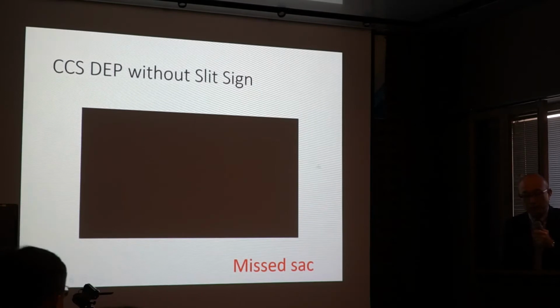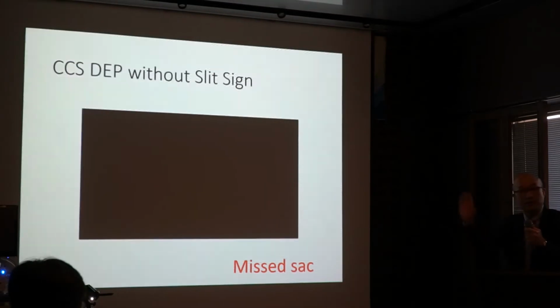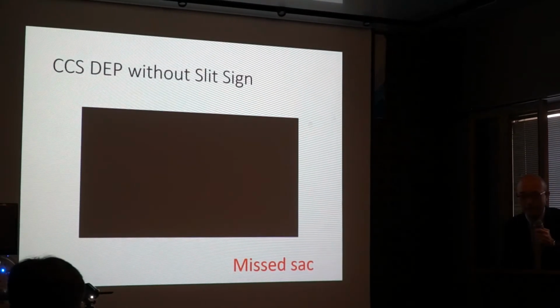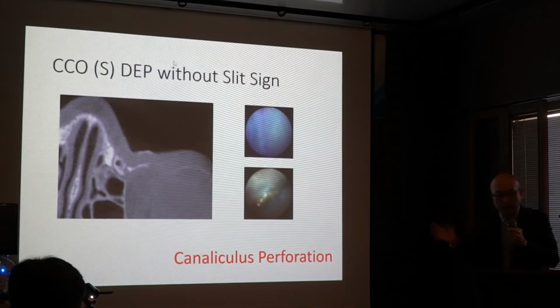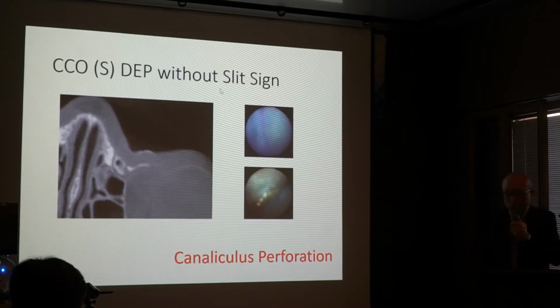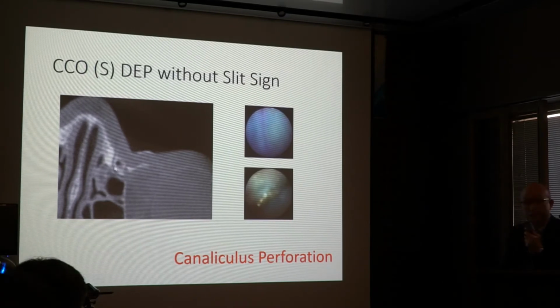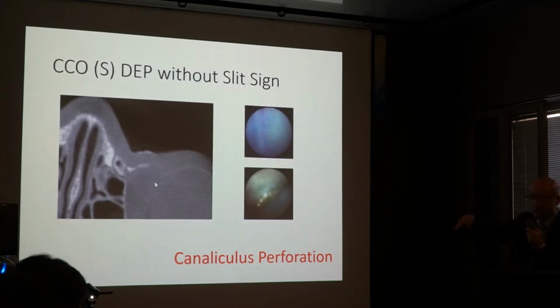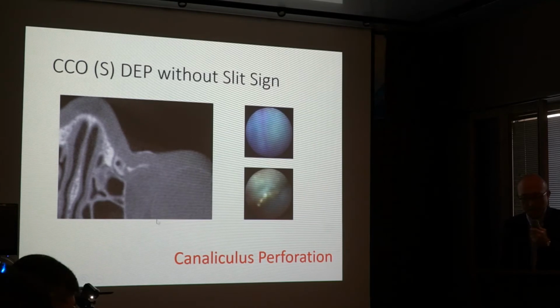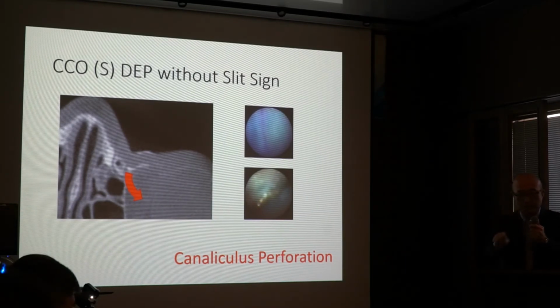So be careful. Common canalicular obstruction or stenosis is one of the major times this happens. And there is a more serious case. When the patient's canaliculus angle is very steep, sometimes we can encounter this kind of patient. In this case, there is a possibility that the endoscope perforates, a full thickness perforation to the orbit.